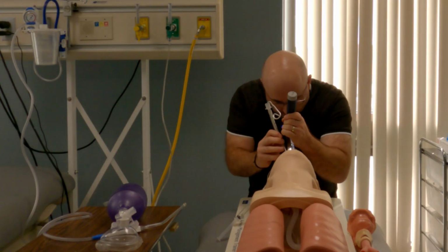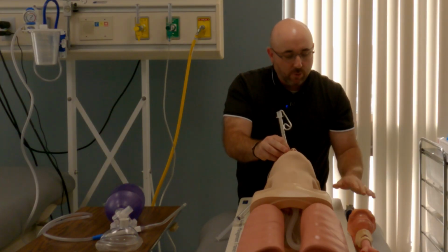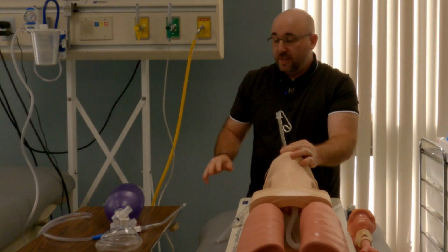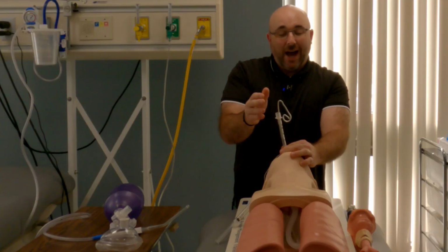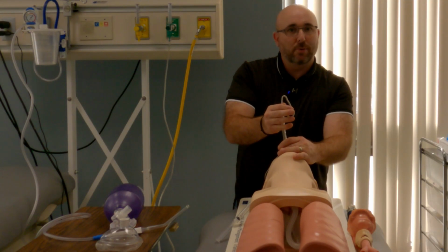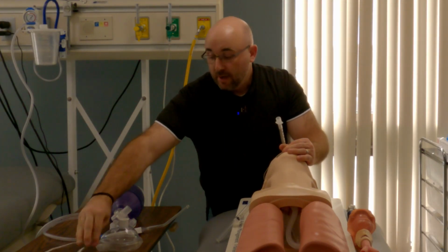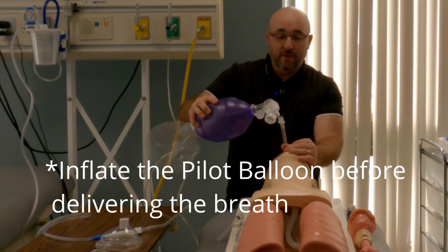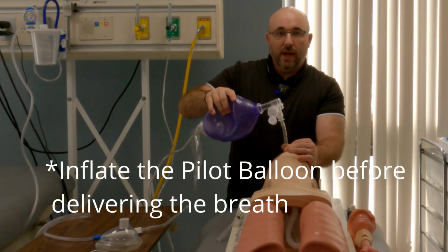So I have inserted it into the tracheal tube. The person that's intubating will close that off. A lot of times we'll secure this. Sometimes I'll hold this, sometimes the person that's assisting may grab this and pull it out. I like to pull it out myself because I know that I have a tight grip, because if you just pull everything at once, it'll pull right out. So I'm gripping the endotracheal tube. This comes out, and then guess what? You are already prepared because you had the mask off. This goes on the end of the endotracheal tube, and we're able to give her a breath.